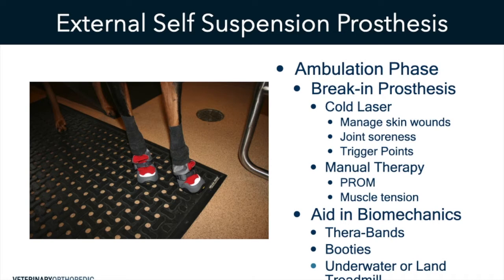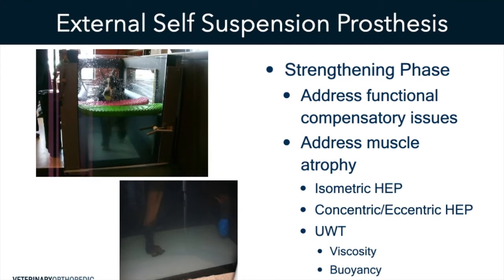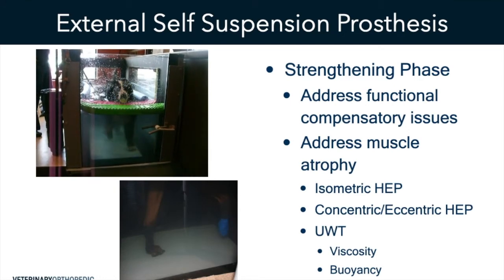So we really have to think of the whole body and whole body health. We're going to aid in biomechanics. This can be with TheraBands, with booties, underwater and land treadmill to help them get used to using it and start to build their mechanics and function, maintaining muscle mass, which we'll talk about in a minute, which is so important. Here we go. So strengthening phase.